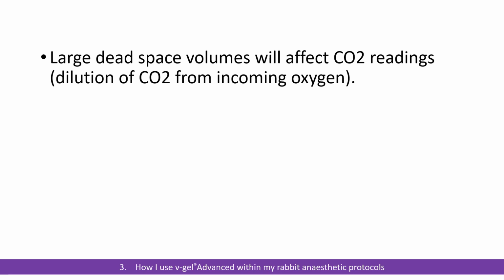With dead space, large dead space volumes are going to do a number of different things. They're going to make it more difficult for your patient to breathe, and that's what we could see in that video there. And sometimes any extra dead space, anything that you put into that rabbit, can cause problems. It's not a big deal if you see that, you just have to ventilate and manage it.